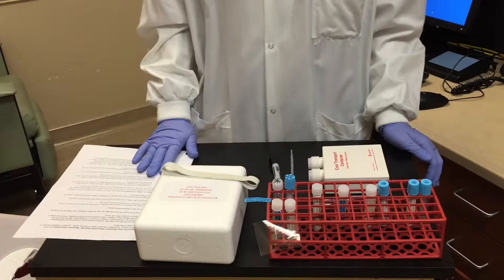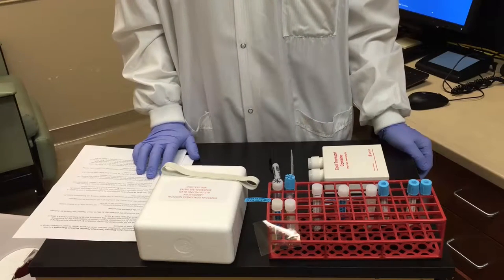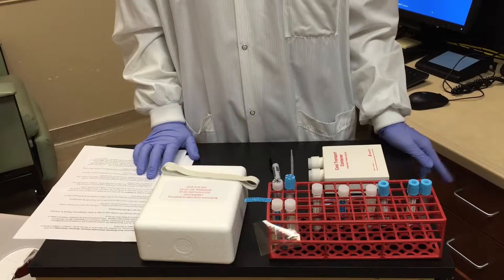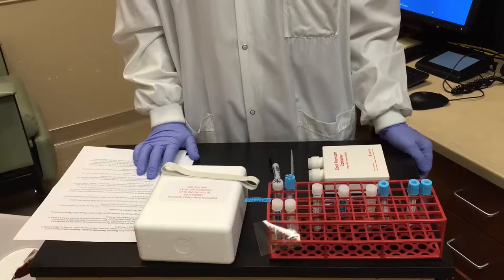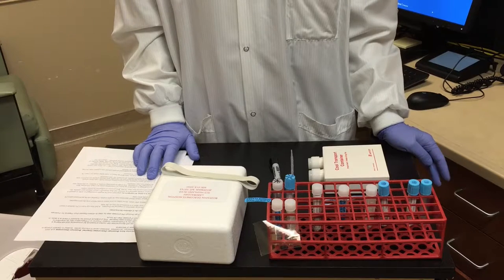Welcome to Bozeman Deaconess Hospital. Bozeman Deaconess is a Joint Commission accredited License 3 Trauma Center located in Gallatin County in the state of Montana. Today we'll demonstrate the correct procedure for processing and packaging a specimen for a prothrombin time, also known as ProTime or PT.